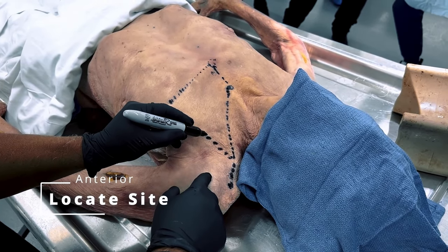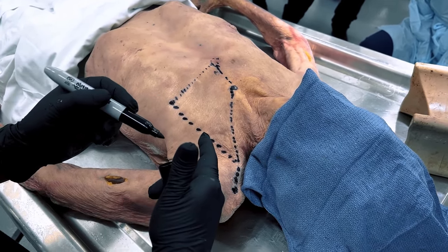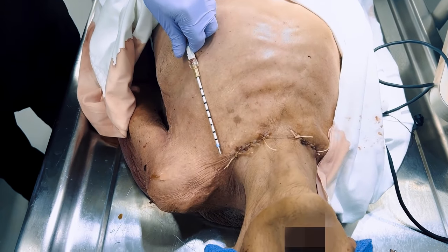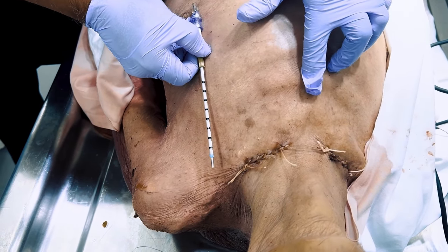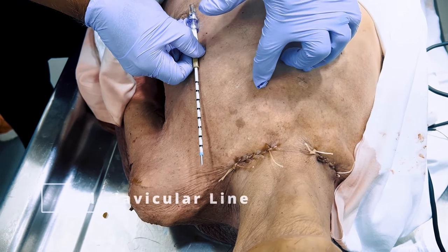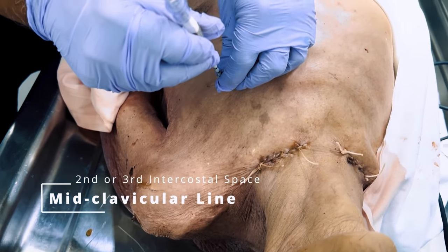The midclavicular line can be located at the midpoint between the suprasternal notch and the top of the shoulder. To locate the anterior insertion site, place your finger in the suprasternal notch. Slide your finger to the sternum until you feel the angle of Louis. Palpate over to the second or third intercostal space on the midclavicular line on the affected side of the chest.